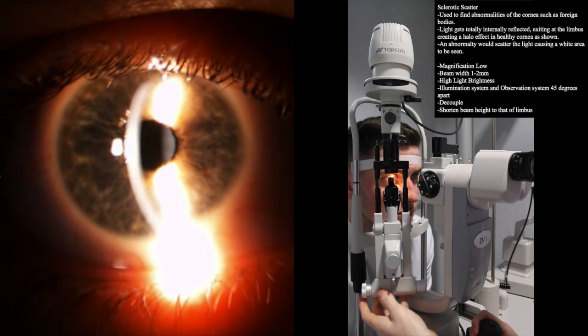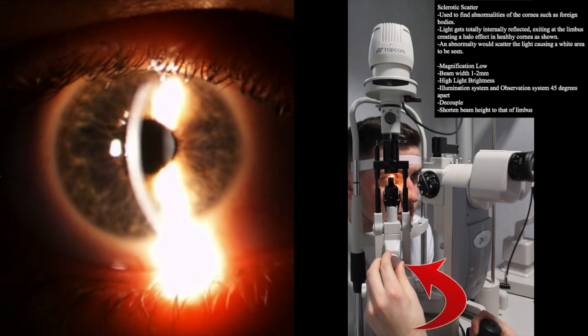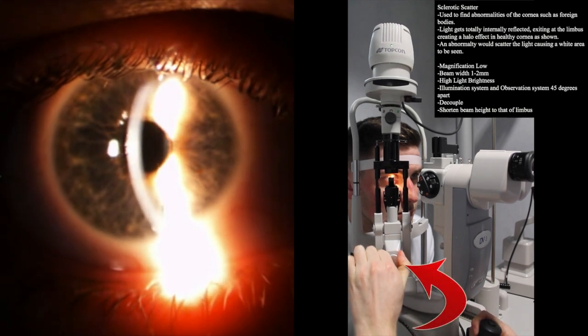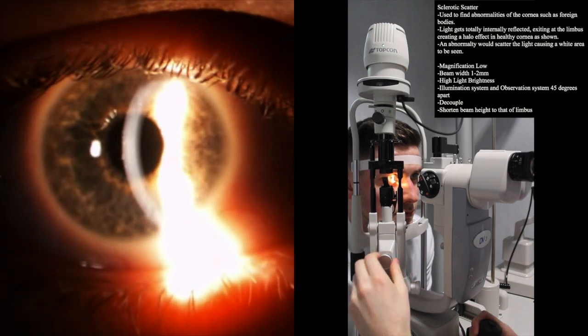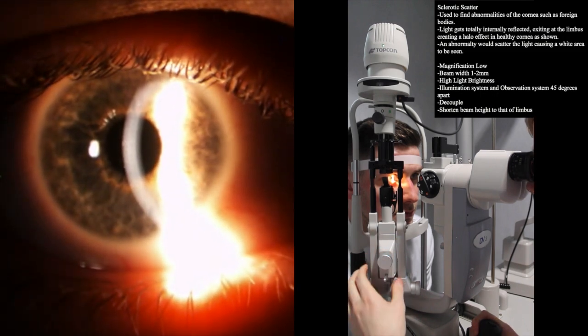To decouple a high stripe slit lamp, you twist this knob on the illumination system anti-clockwise to loosen it. This will allow the beam to be decoupled onto the temporal edge of the cornea as shown.